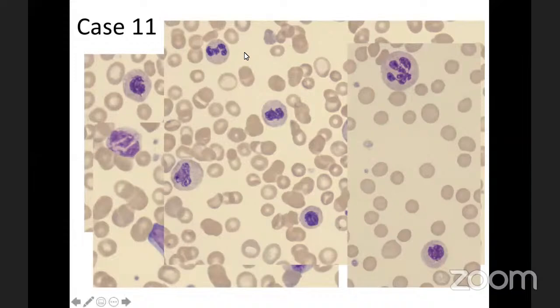So what do you think? Chronic neutrophilic leukemia, a good differential. However, in a chronic neutrophilic leukemia, you wouldn't have dysplastic features. Pelger-Huet anomaly, usually could be, but with Pelger-Huet anomaly, they wouldn't have this abnormal leukocytosis, and the patient should be detected early in life.